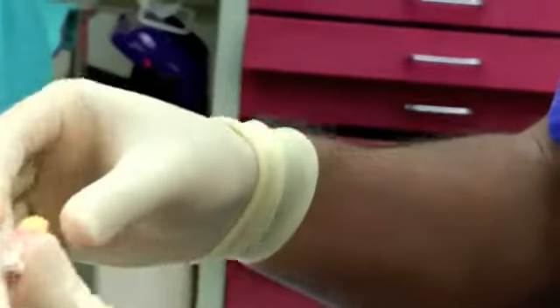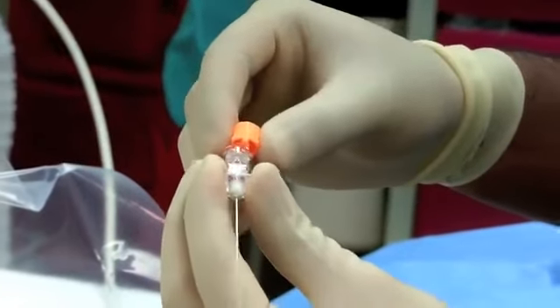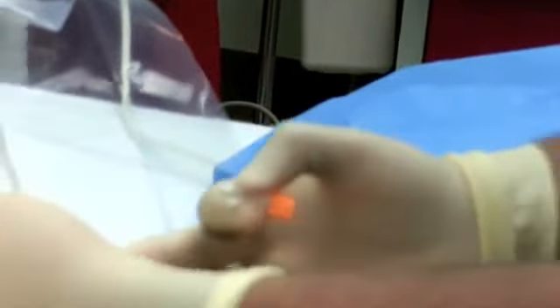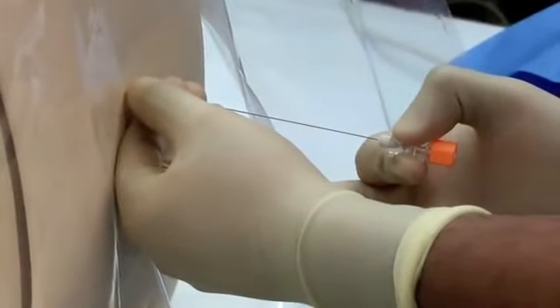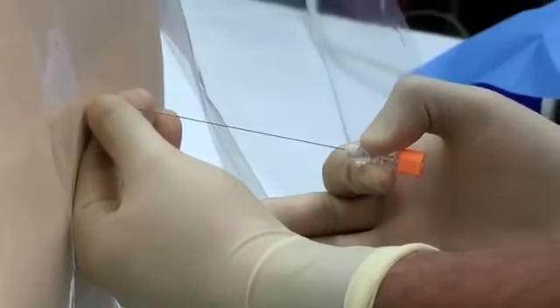So, as you can see, there's a stylet inside the spinal needle. And I will now advance through the anatomic structures until the subarachnoid space is reached. You may experience a popping sensation as the ligamentum flavum is crossed.